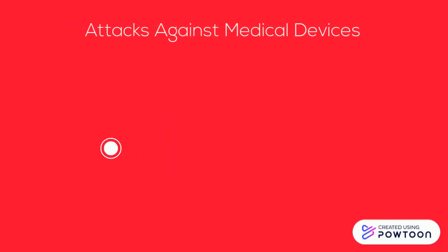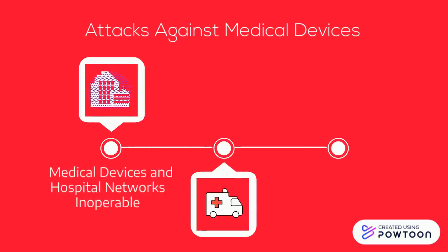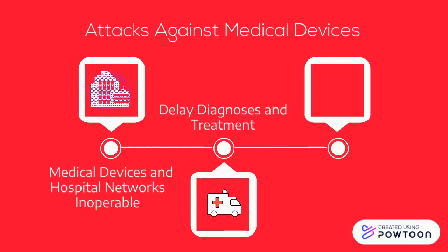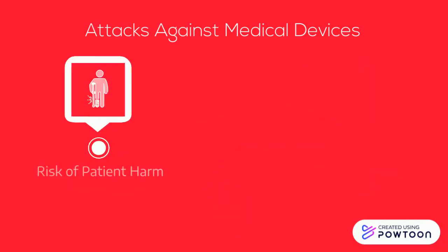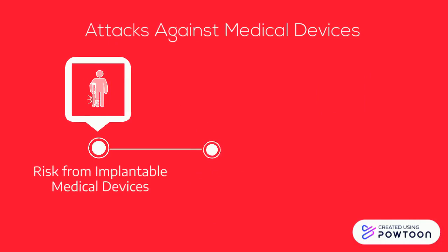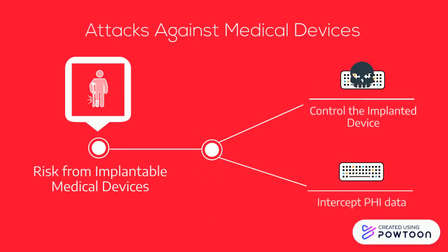Cybersecurity attacks have rendered medical devices and hospital networks inoperable and disrupted the delivery of patient care. This has the potential to delay diagnoses and treatment and lead to patient harm. The risk of patient harm is particularly worrisome in cases of implantable medical devices. Vulnerabilities could be used to control the implanted devices or intercept data such as protected health information.